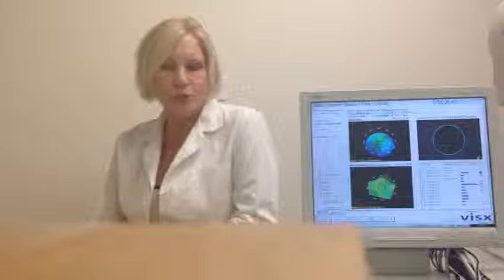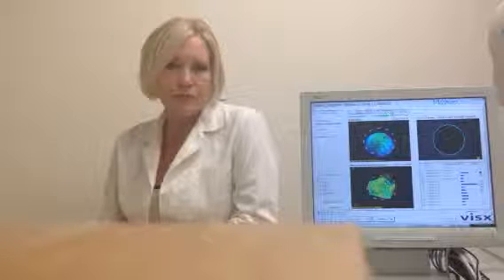I give you a full eye exam, and I will tell you whether your prescription is stable, whether it's changed significantly since your last prescription. I will check the inside of your eye, the retina, to make sure that there's no issue with that, or with your optic nerves. I check for glaucoma. I check your color vision. And then most important of all, with the new technology, we do an extensive 3D mapping of the surface of your eye, which is called the WaveScan wavefront analysis.